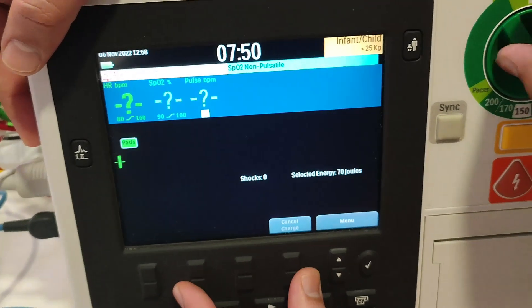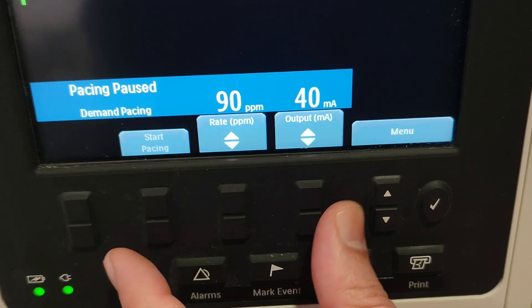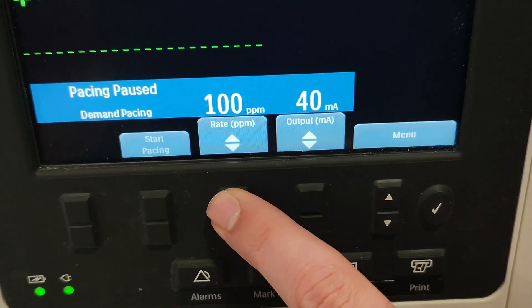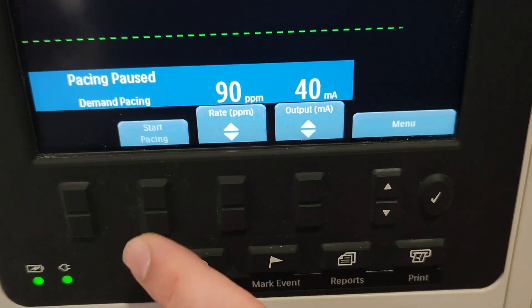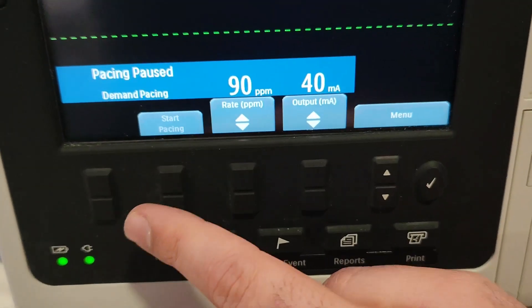These functions are highlighted when transcutaneous pacing is on. When the pacer is active, these controls are highlighted. This one is for the output — you can increase or decrease the output. This one is for the heart rate. And this one is to start pacing: once it's attached and there is an ECG, press the start button to begin pacing.